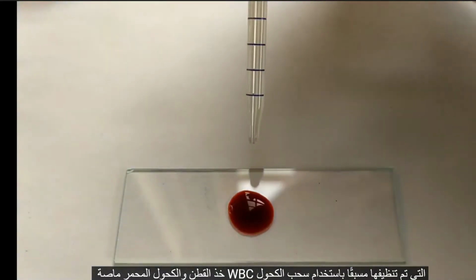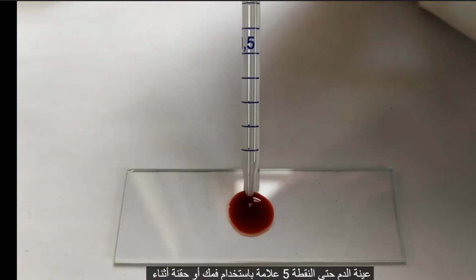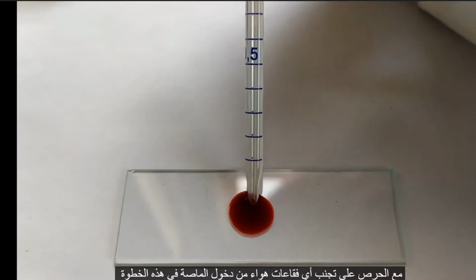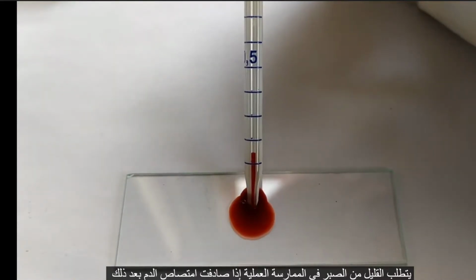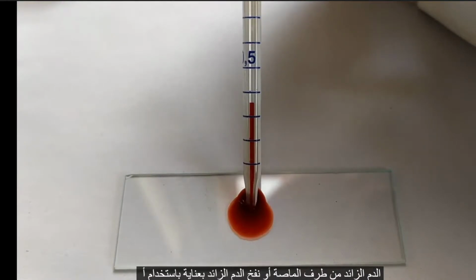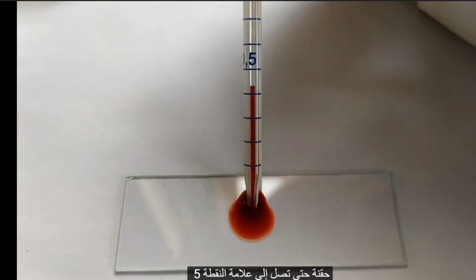Take the WBC pipette pre-cleaned with alcohol. Draw the blood sample till the 0.5 mark using your mouth or a syringe, while taking care to avoid any air bubbles from entering the pipette. This step requires a bit of patience and practice. If you happen to suck the blood beyond the 0.5 mark, you can either use a clean filter paper to carefully blot out excess blood from the pipette tip, or carefully blow out excess blood using a syringe until it reaches down to the 0.5 mark.